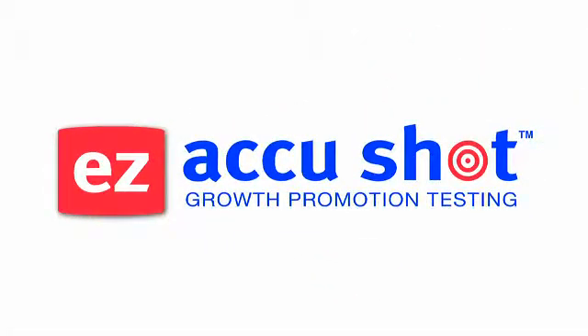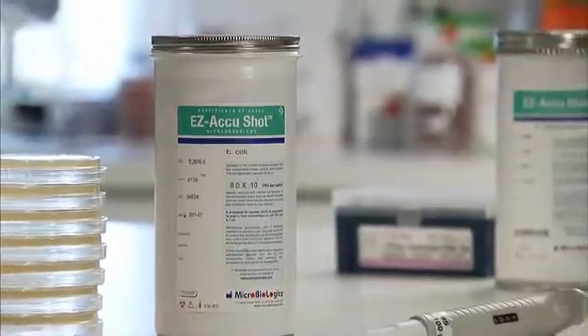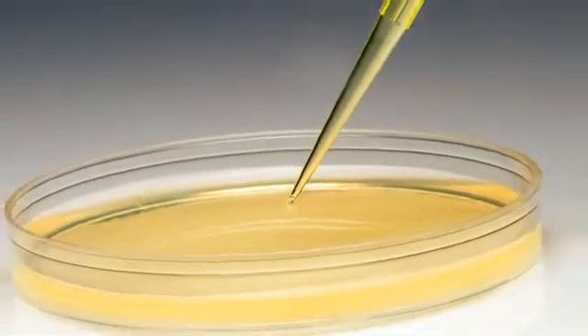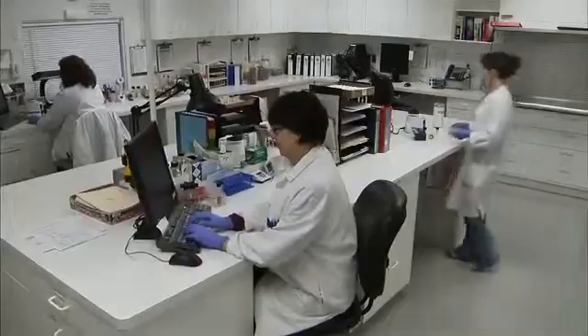Microbiologics Easy AccuShot is a quantitative microorganism preparation for growth promotion testing. Each lyophilized pellet is guaranteed to deliver less than 100 CFU per 100 microliters of hydrated suspension and is traceable to an original reference culture strain recommended by the pharmacopoeias. With Easy AccuShot, accuracy and traceability have never been easier or more affordable. Pellets instantly dissolve.